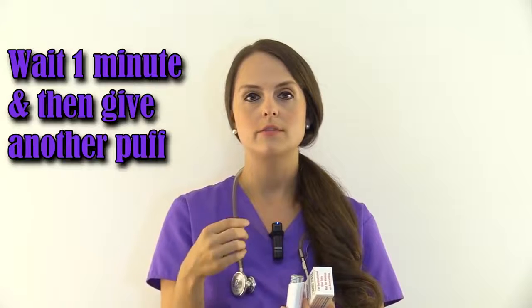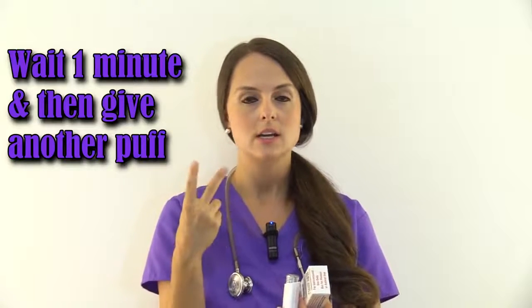Now, say you were giving 2 puffs of a bronchodilator and that was it, or 2 puffs of the corticosteroid and that was it. You would first do a puff of the bronchodilator, and say they need another bronchodilator puff. You would wait 1 minute and then give the other one. So if you're giving the same medication, just 2 different doses, you're going to wait 1 minute. But if you were going to give a bronchodilator then a corticosteroid, you would wait 5 minutes, because we need 5 minutes for the bronchodilator to do its job.